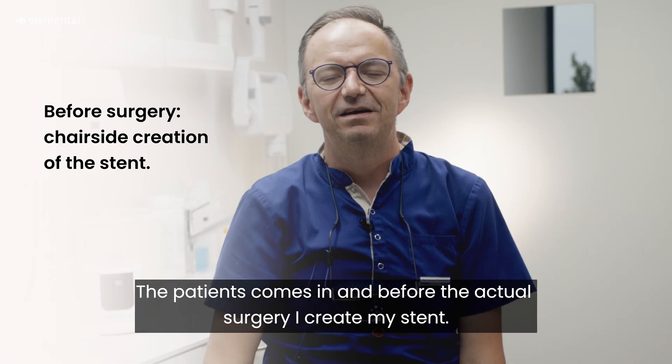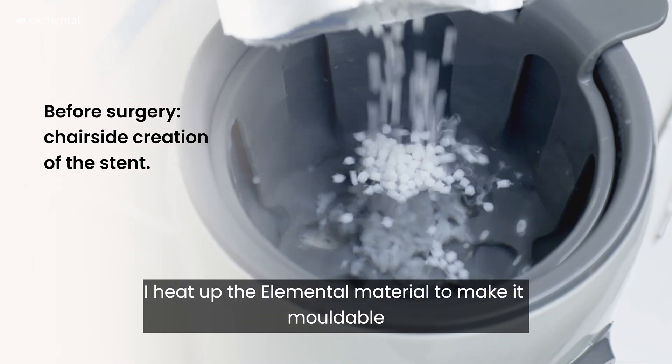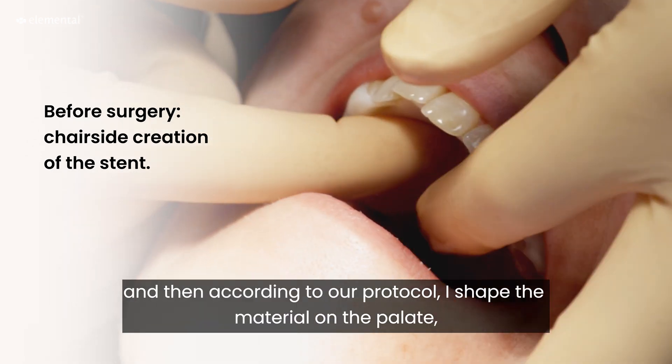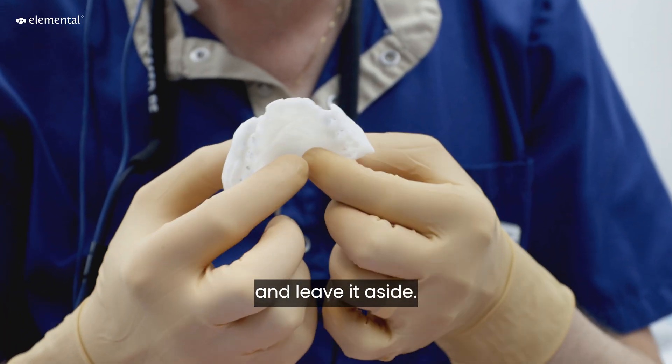The patient comes in and before the actual surgery I start with creating my stent. I heat up the Elemental material to make it moldable and then according to our protocol I shape the material on the palate, take it out and leave it aside.